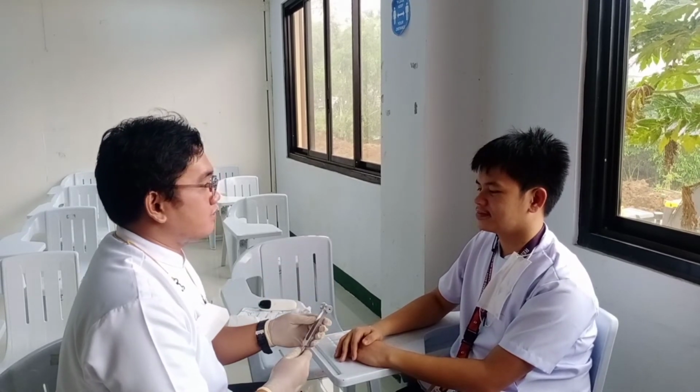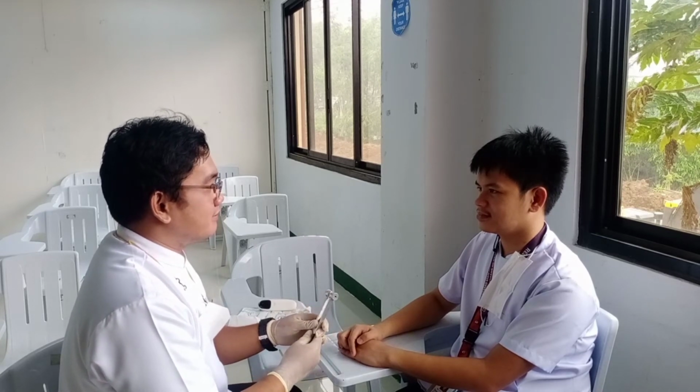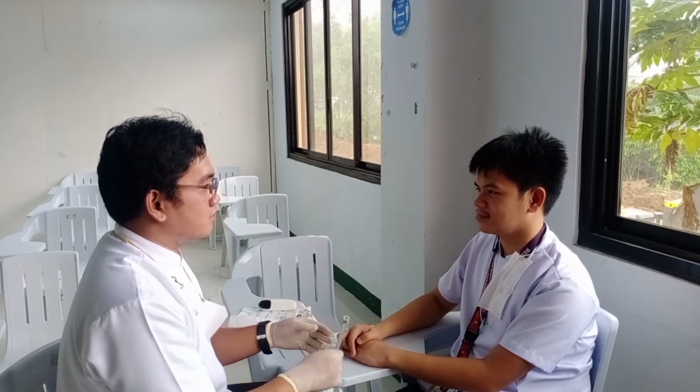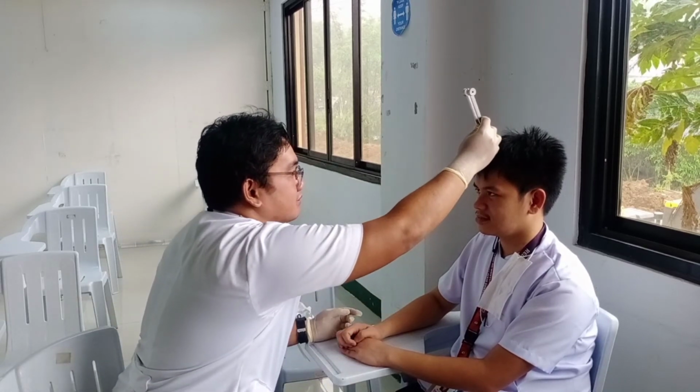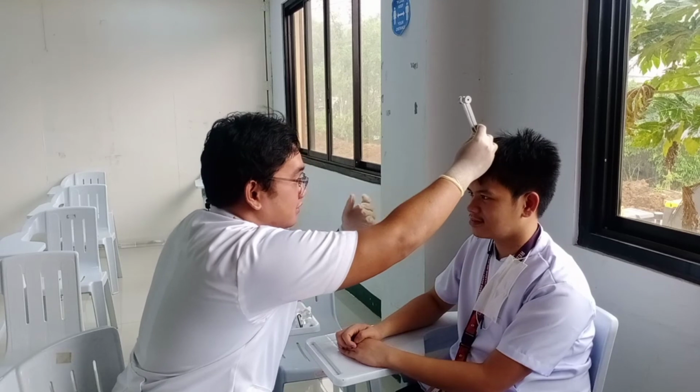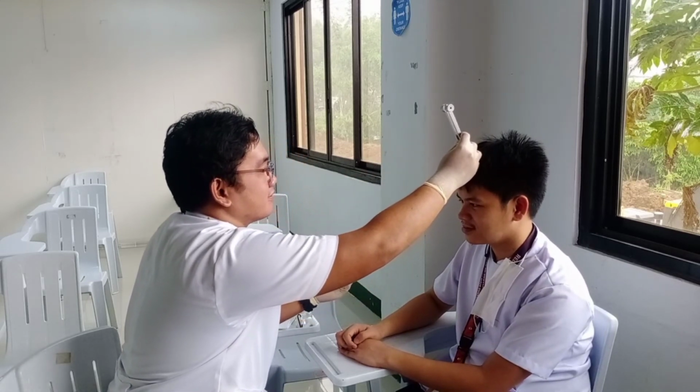Tuning fork test. Hold the tuning fork at its base and strike it on the table. This is to produce a sound. On the Weber test, this is to assess the conduction of the ear examined. Place the base of the vibrating fork on the top of the client's head. This is to allow upward transmission of the sound. Ask the client where he hears the noise, and this is to determine whether the result is negative or positive.